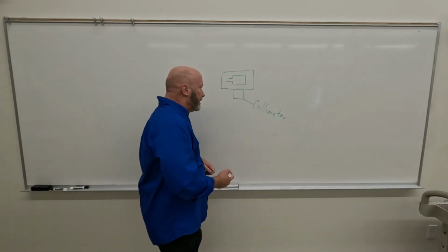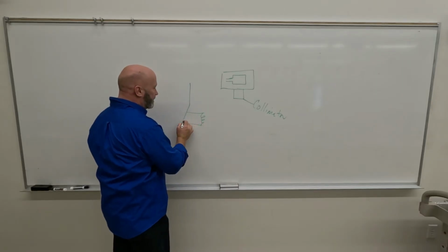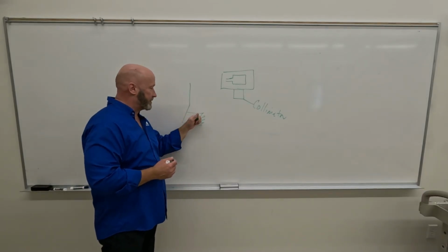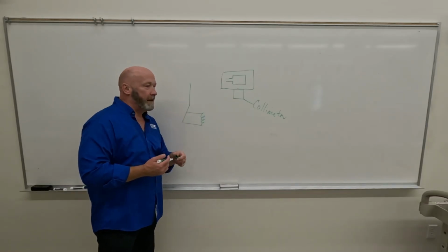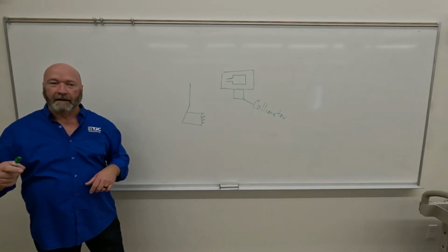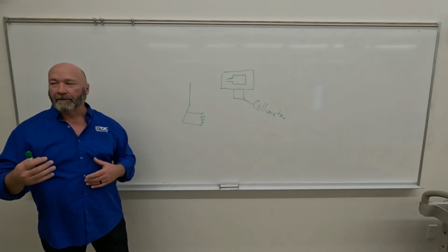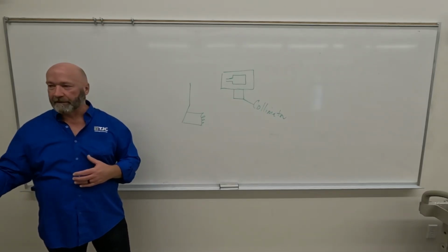So when we send the electrons across the tube, it's not X-rays, it's electrons. When we send the electrons across the tube, at the point of impact, an X-ray photon has equal likelihood of being created and projected in any particular direction, right?